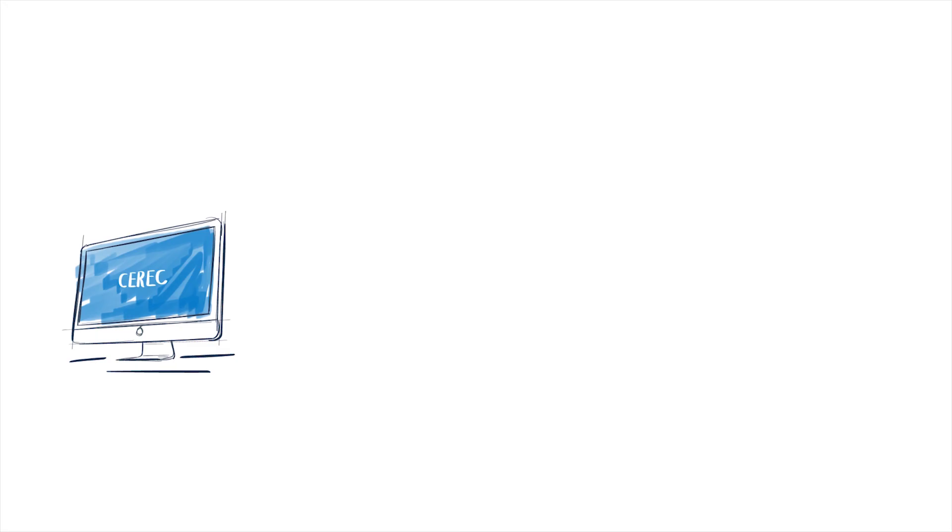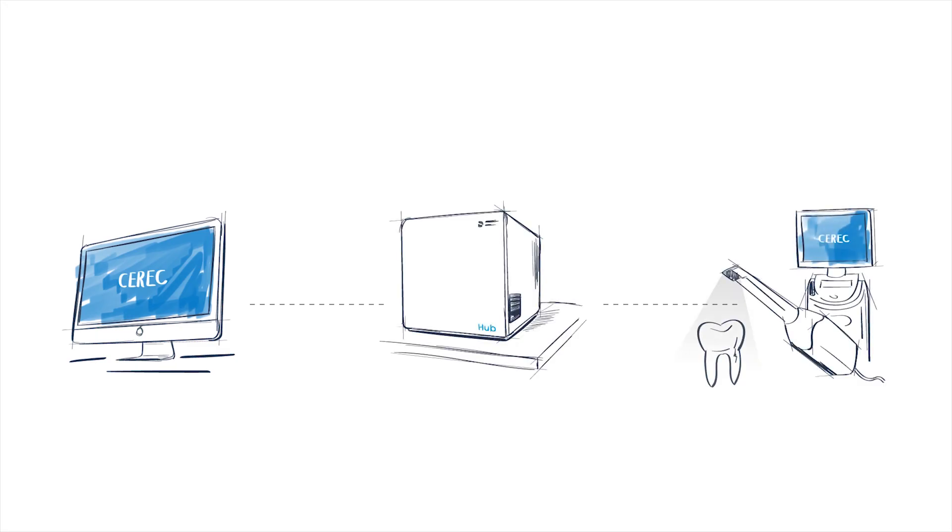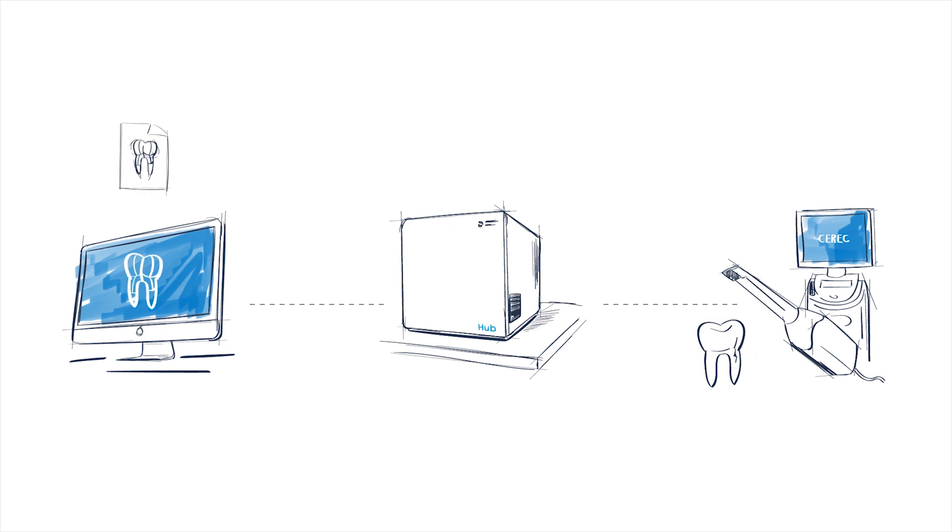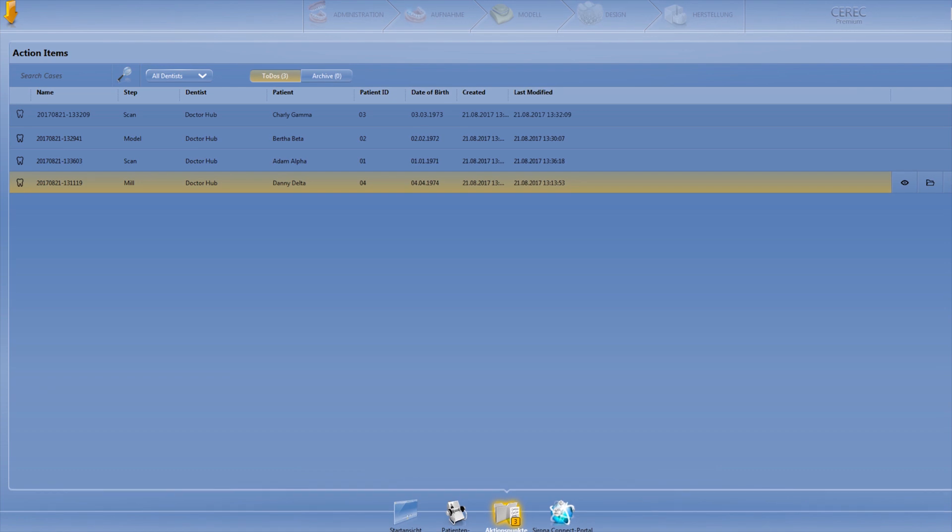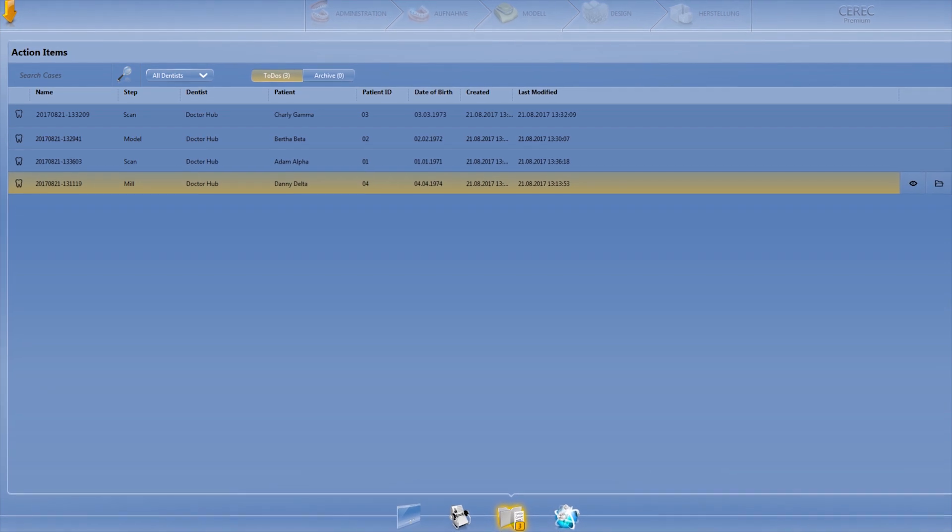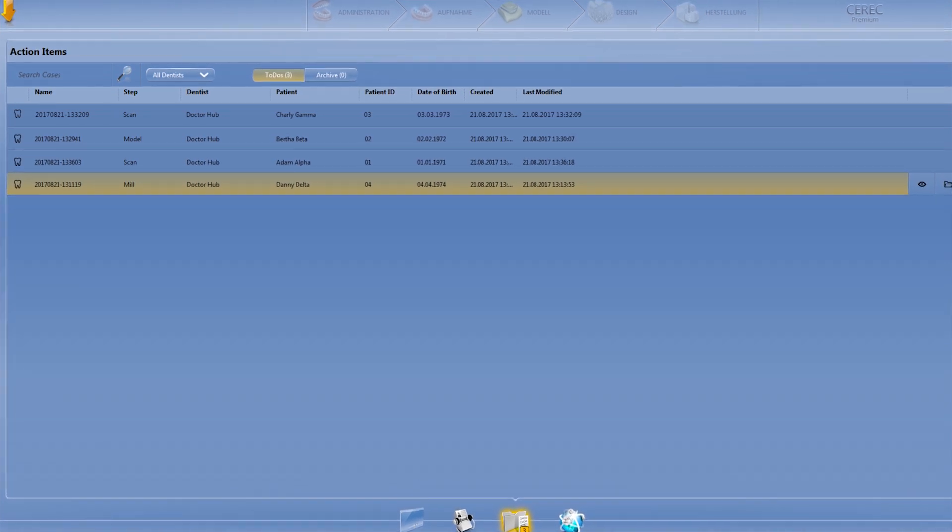A technician has a full view of every scan just taken by the OmniCam. He can open them, design, and mill without having to worry about exporting or importing files.